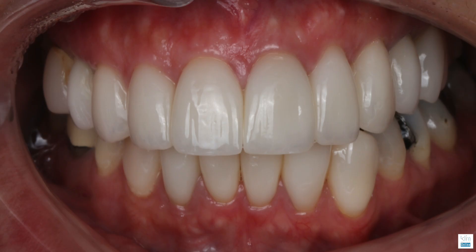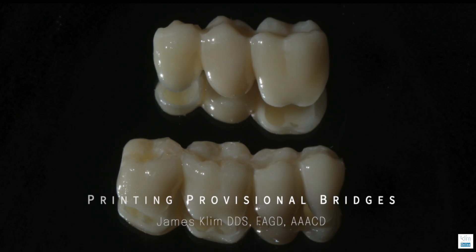Or here I have the PM7 from Ivoclar, which is a 5-axis miller, and I can move into that. The other thing I see valuable in Exocad is when I'm doing larger cases — I print my provisionals, and I usually design that in Exocad. It's a very efficient turnaround time once you learn it and for the printing, so that's very proficient.